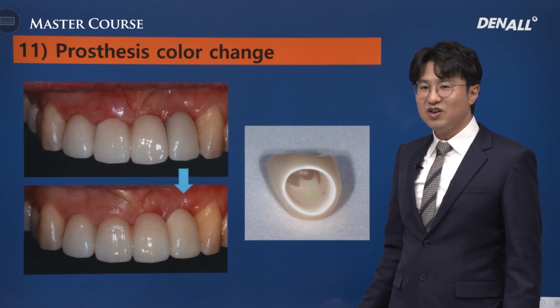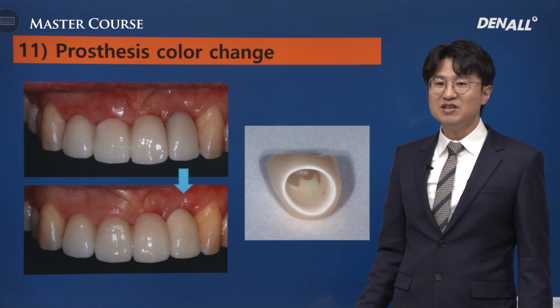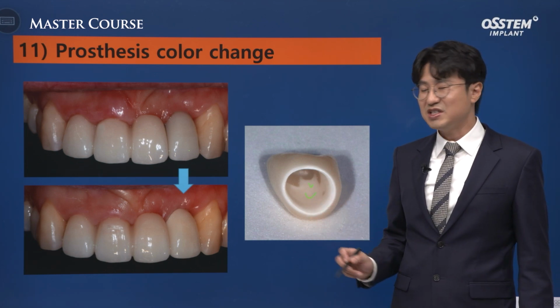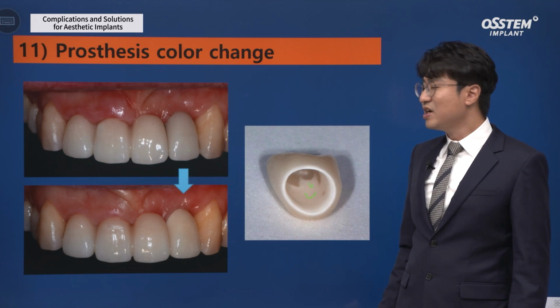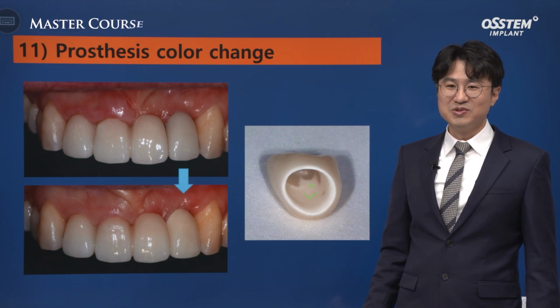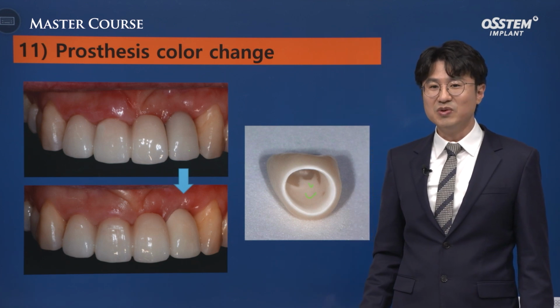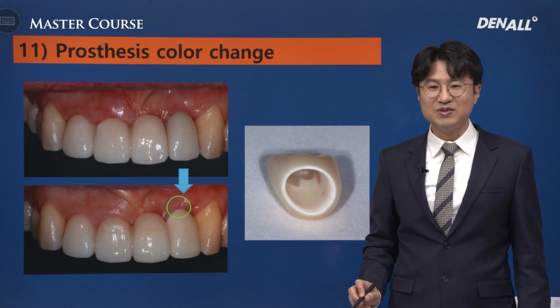In order to address the problem, the abutments themselves should have a gold color, or Ti-link abutments can be used to treat it with zirconia rather than using the metal color. If it is thick enough, the metal or opaque would not be showing, but if it is thin like this, that should be considered. Recently, I use PFM for anterior implants. With the PFM restoration, if the metal margin is increasing later, it can be very unaesthetic, but the color of the abutment is metal, so I don't think a PFM would create a particular problem.